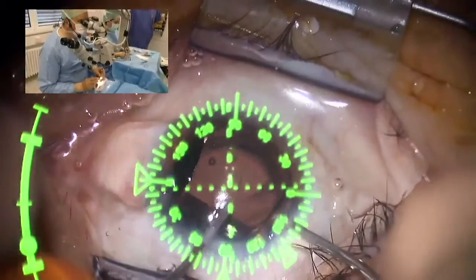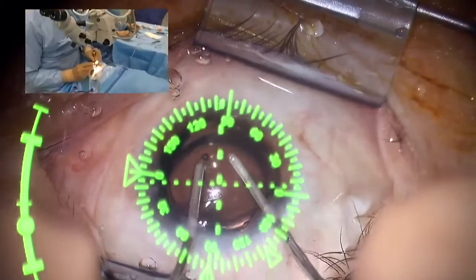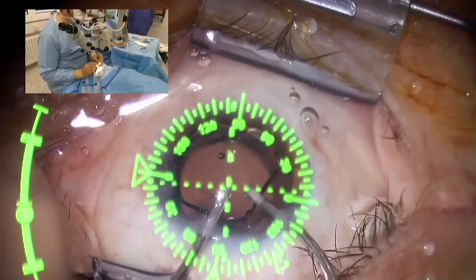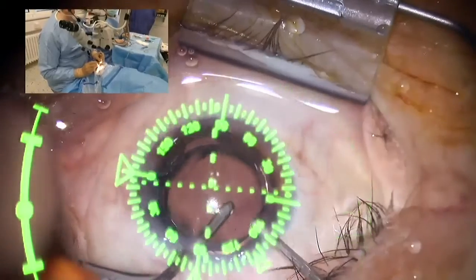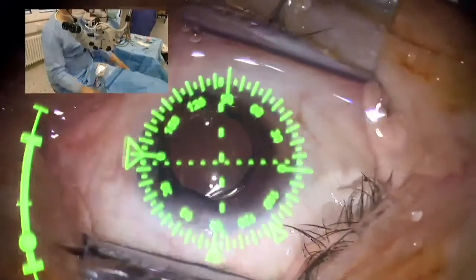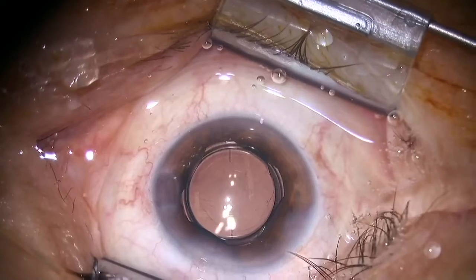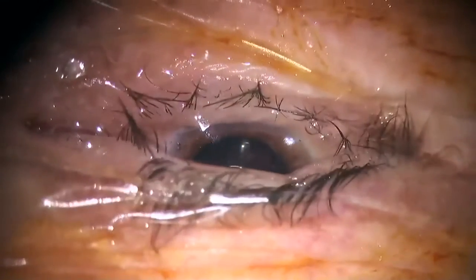Das ist ein kleiner Druck nochmal. And it's also important to remove the viscoelastic between both lenses. Wasser? Oh, ich hab. So. Okay. Ganz locker. Und zu mir mal schauen, bitte hier hoch. So, here we are. That's it. Sehr gut. War das schlimm? Ja. Ging alles super, haben Sie gesagt, ne?